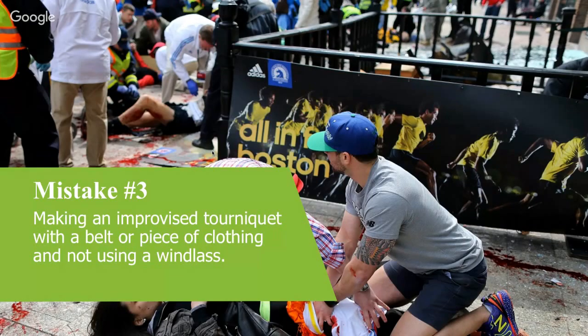I don't know too many methods of making an improvised tourniquet with a belt and it being effective. Same with clothing. You can make an improvised tourniquet out of clothing or out of a triangle bandage, but again, it's about using a windlass to get that compression.